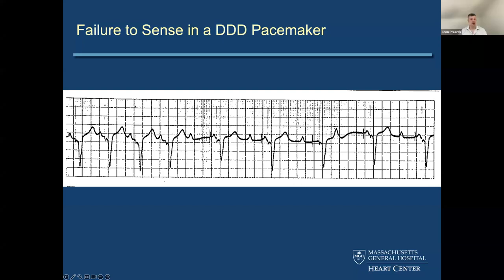Yeah, sure. So here's sinus rhythm. There's no pacing spike here, just P waves. But every time you see, for these first four beats, every time you see a P wave, you see a pacing spike and a QRS complex. So it's atrial sensing ventricular pacing. Then you've got a P wave that comes in pretty much on time with the earlier ones, right? So you have actually two things happening here, only one of which I highlighted earlier for the sake of simplicity.